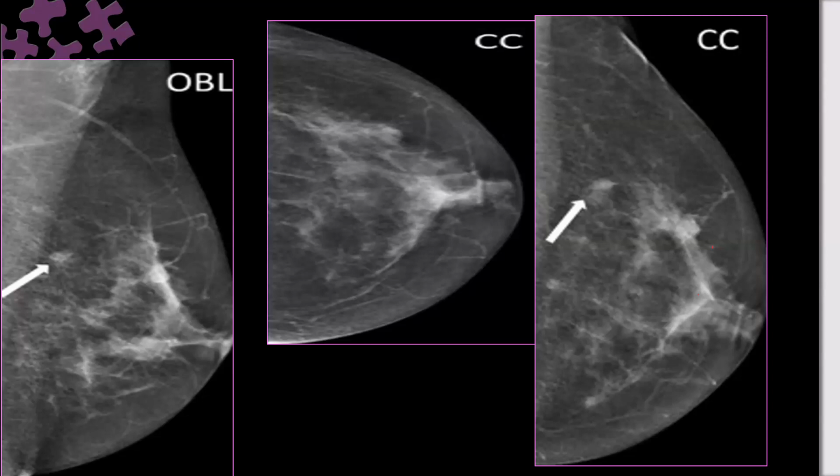Because when you do this view, as we explained last time, you go more lateral and you pull the lateral portion forward. That is why the pectoralis appears here. So when you see the pectoralis, that means the inclusion criteria is optimum. You can see until the end of the posterior breast is included. That is why with this view you can appreciate the posterior breast. Okay.